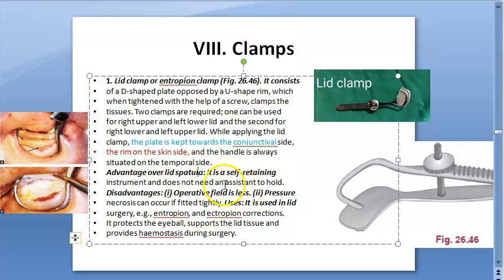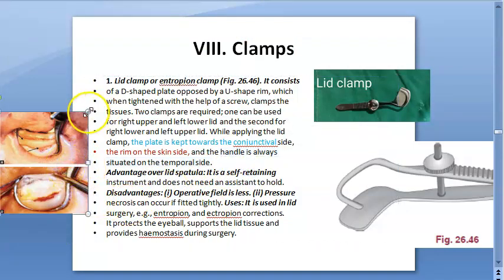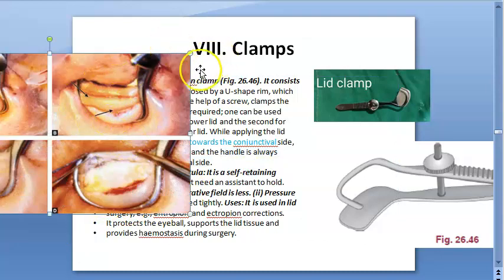The handle is always situated on the temporal side. That's what they seem to be doing here — the handle is on the temporal side.